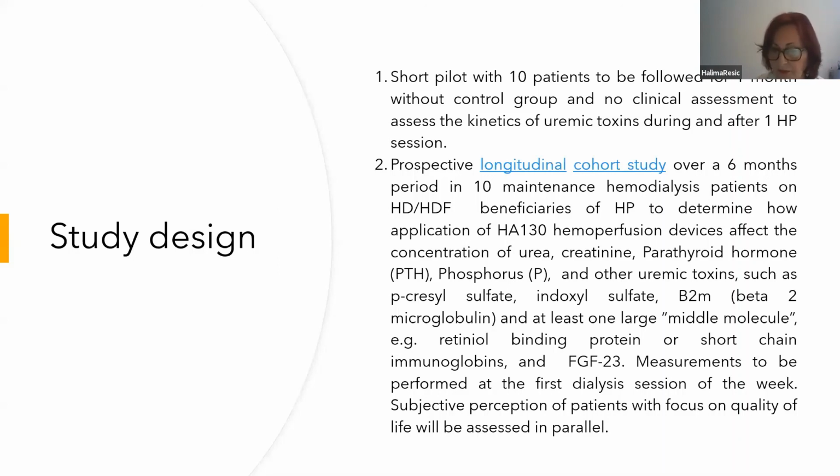Measurements to be performed at the first dialysis session of the week, and subjective perception of patients with focus on quality of life will be assessed in parallel.